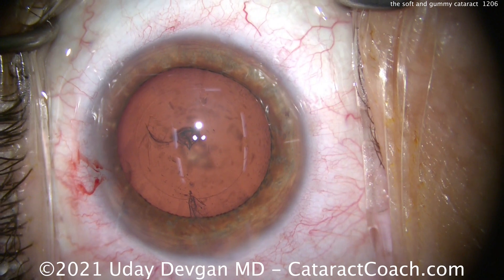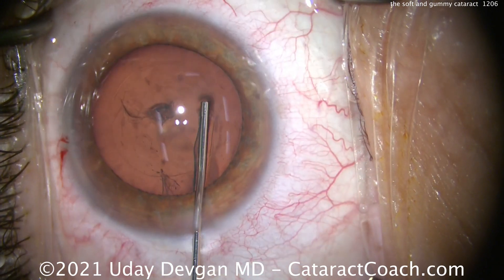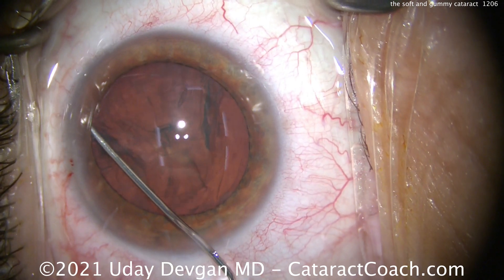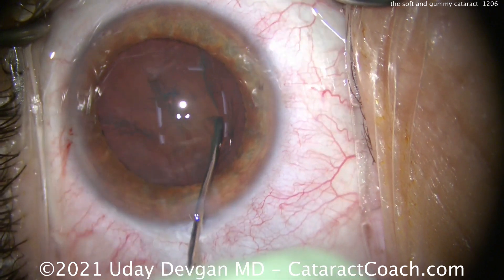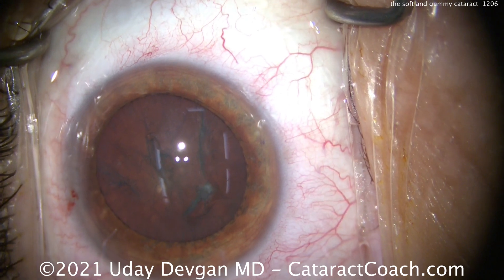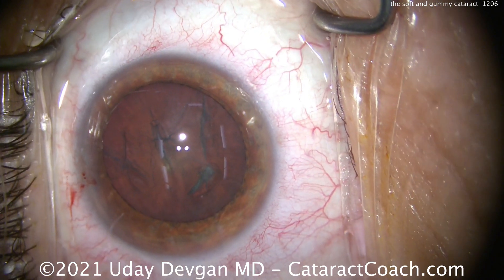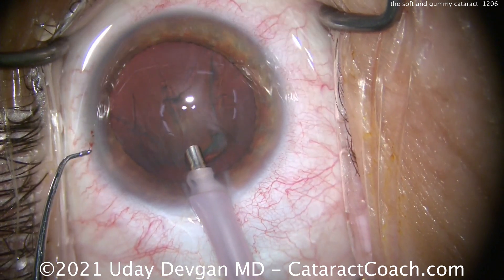We want to make a beautiful capsulorhexis here. For a patient who does a lot of nighttime driving, we want to put in a monofocal lens with a goal of plano in both eyes — sharpest distance vision and the highest quality of vision. If it were a softer lens, I'd just do more hydrodissection and get that nucleus prolapsed into the anterior chamber. But there is some density there, and I don't feel like I want to try to prolapse it into the anterior chamber, especially through that rhexis which is about 5 millimeters in diameter. So we're going to try the FACO probe and try to chop it.